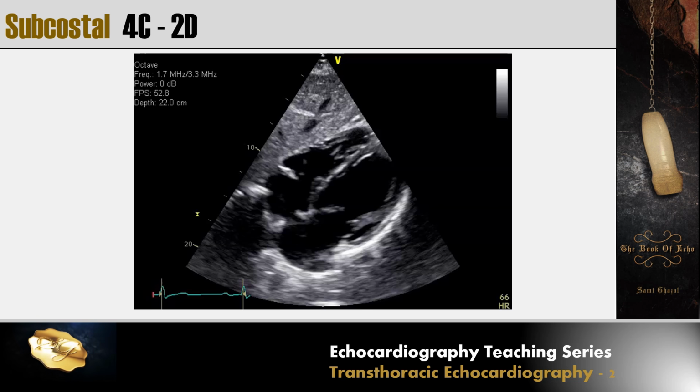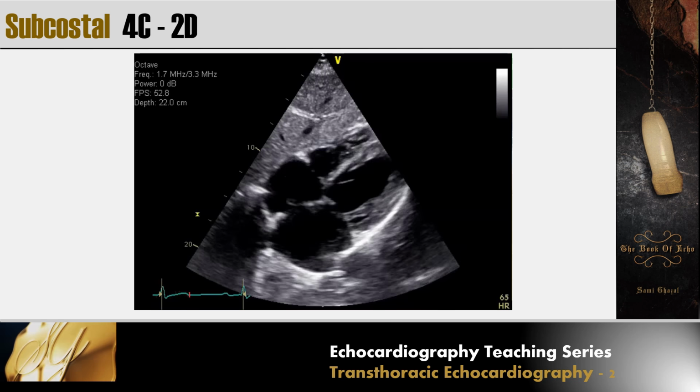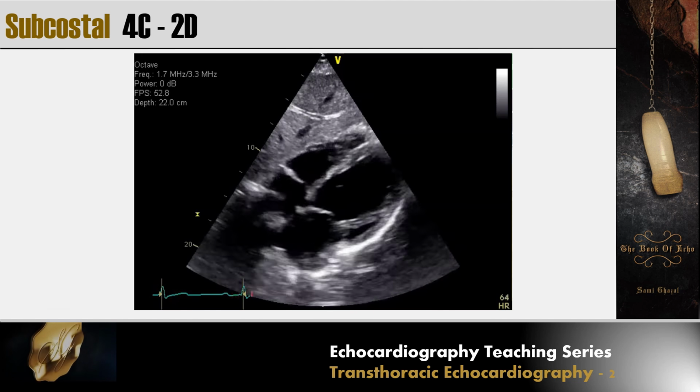Shifting to the subcostal window. The first video which is acquired here is the subcostal 4-chamber view.